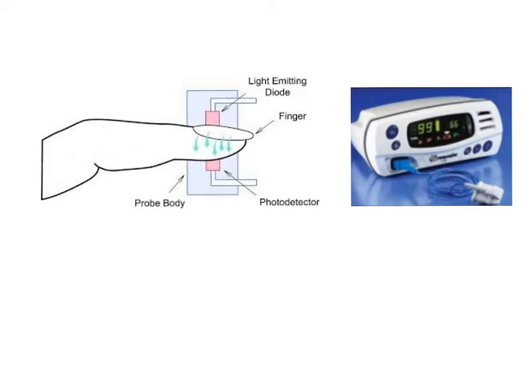blue purple color. The oximeter first measures the sum of the intensity of both shades of red. This is representing the fractions of the blood that are with and without oxygen.